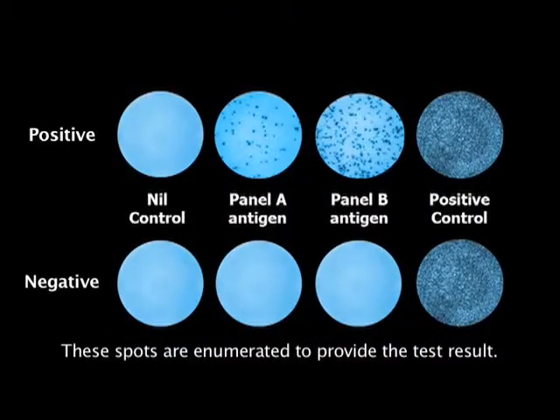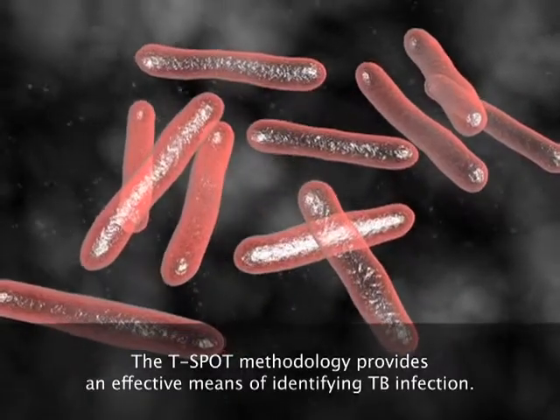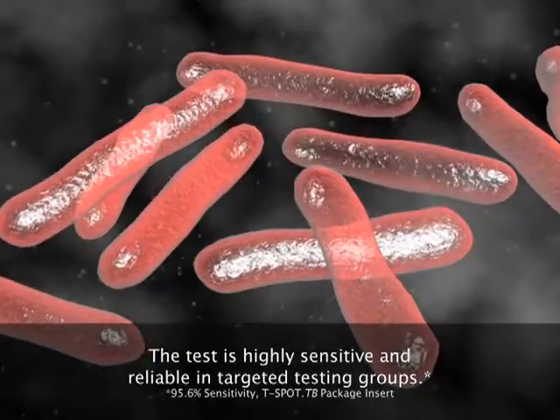These spots are enumerated to provide the test result. The T-spot methodology provides an effective means of identifying TB infection. The test is highly sensitive and reliable in targeted testing groups.